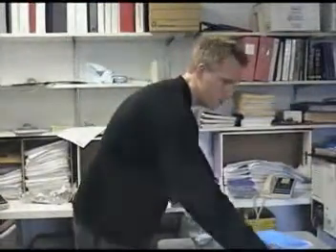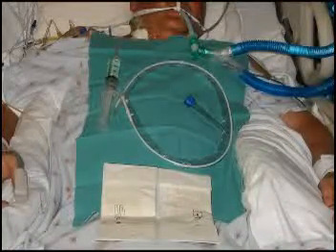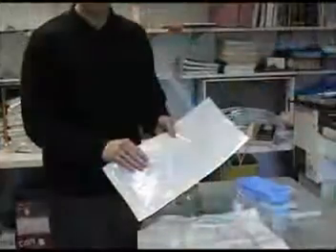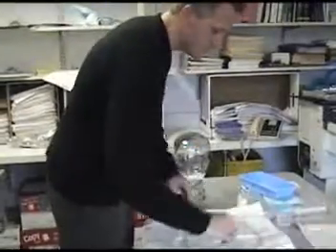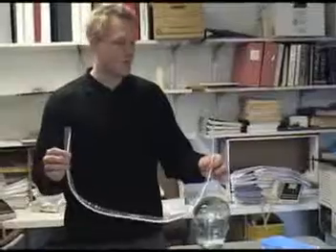Put your specimen container to the side, open up your Combicath, and place it on the patient. What I'd like you to notice is there are also directions in the package insert. If you'd like to refer to those going forward, please do. Your Combicath comes in a sheath. This is also for sterile technique.